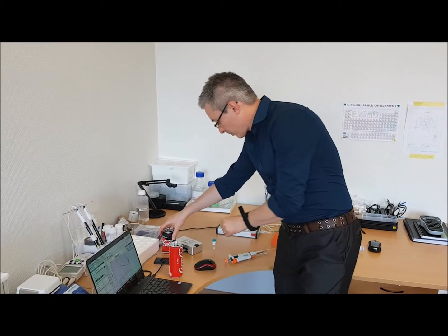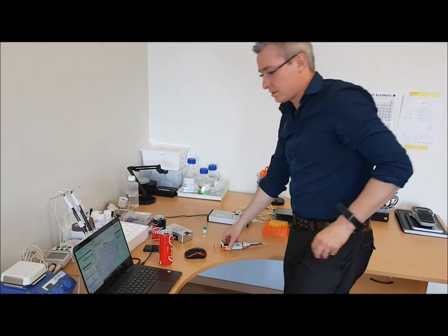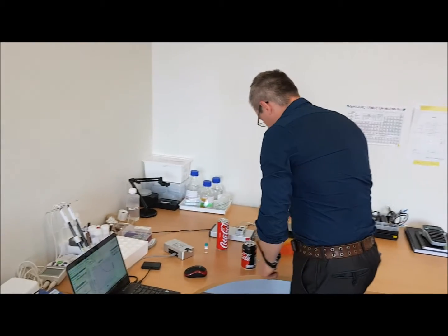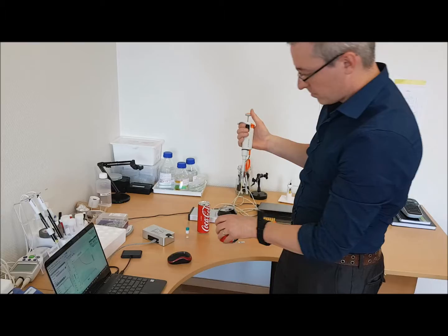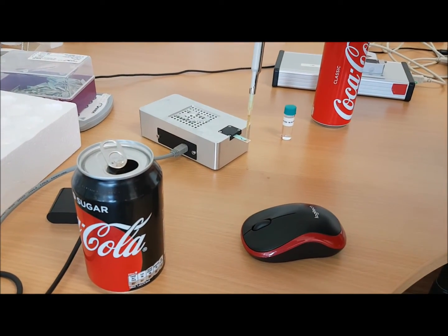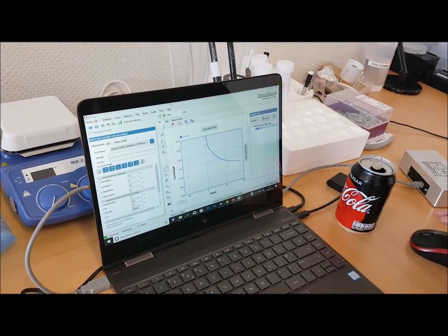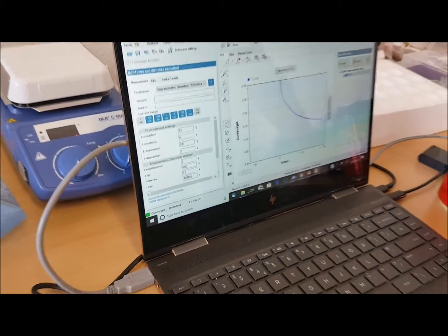I'll put the sensor into the Anapot. Then I'll take some Diet Coke and a clean pipette. I'll put it on the sensor and start the software. It's a very simple assay — applying a voltage of 650 millivolts, with a save rate of about one second, and it will run for something like 30,000 seconds.